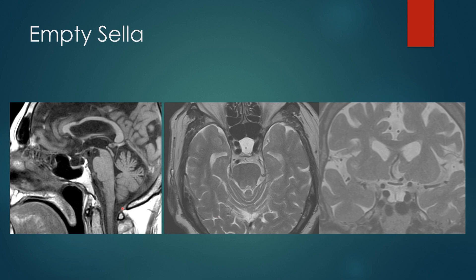We commonly see what we call an empty sella — it's where the sella is expanded and full of CSF. You can either see pituitary tissue flattened along the bottom, or sometimes it's so thin you don't see it at all. The pituitary stalk is still present, but on T2-weighted images it is full of hyperintense T2 signal corresponding to CSF, with the pituitary infundibulum running through the middle. On the coronal, you can see the optic chiasm, the pituitary infundibulum, and that thin band of pituitary tissue along the bottom of the sella.